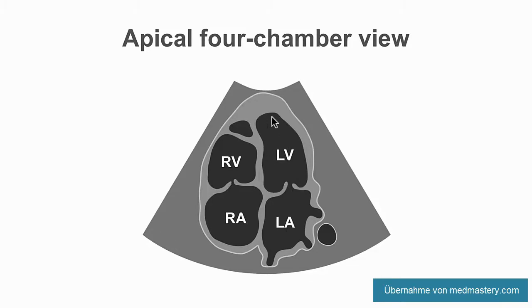In a normal heart, the left ventricular apex forms the apex of the heart. If the right ventricle becomes dilated, it can push it over. But this is a normal situation we're looking at here. We've got 3 of the 4 pulmonary veins coming into the left atrium, and then this circular structure outside of the heart, so it's outside of the pericardium, is the descending aorta.